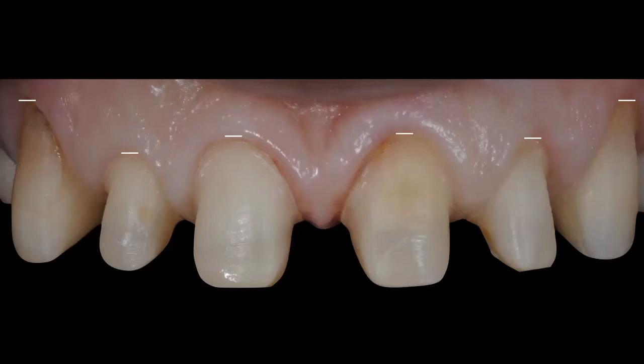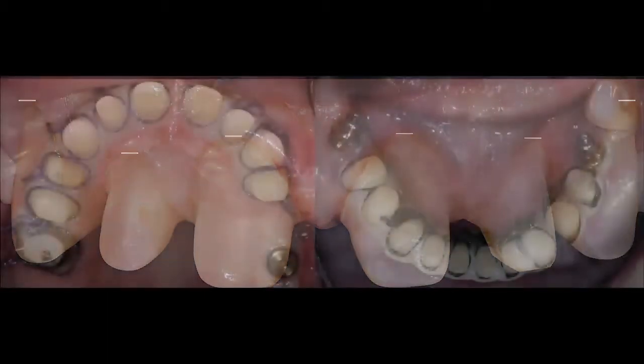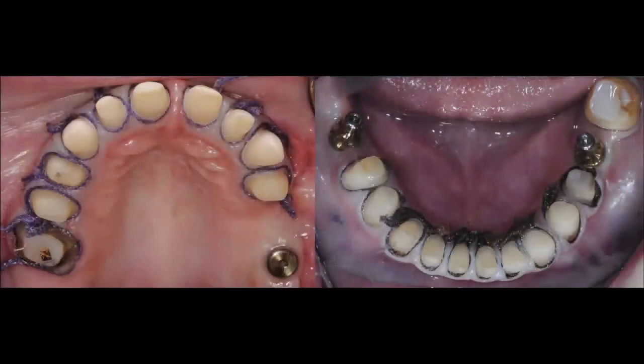I just wanted to demonstrate this to you by sharing with you this case right here. It's a full mouth upper and lower case that I'm going to complete. And I decided to use a combination. I'm going to use zirconia as my final ceramic restoration, so my substrate is going to be zirconia. But we all know today, and we'll review this in a couple of slides, that we have different types of zirconias.